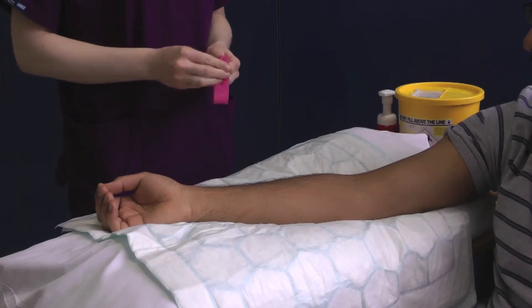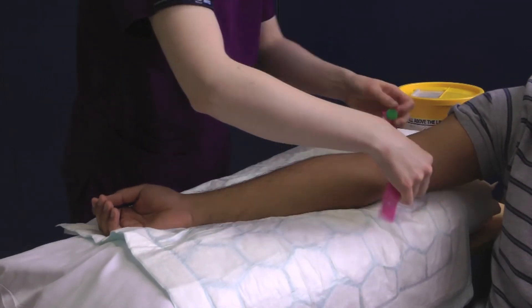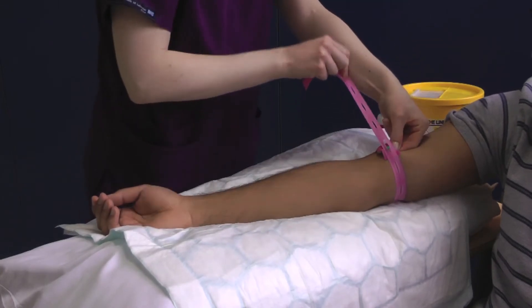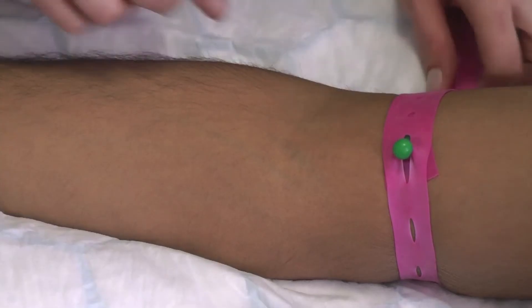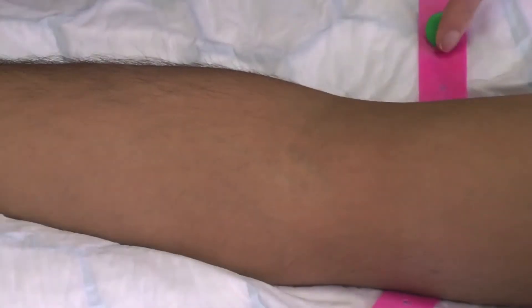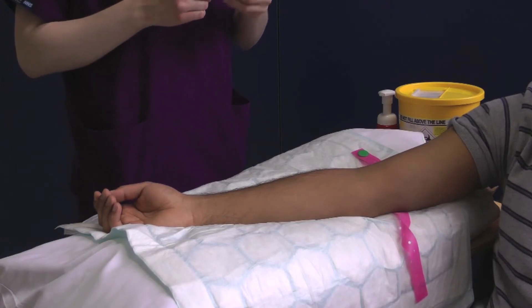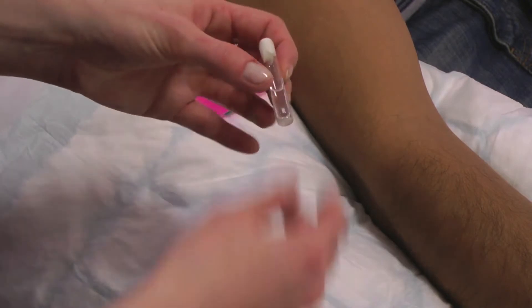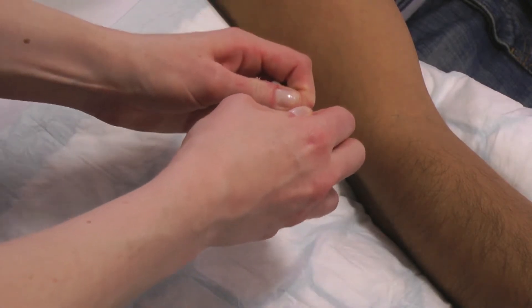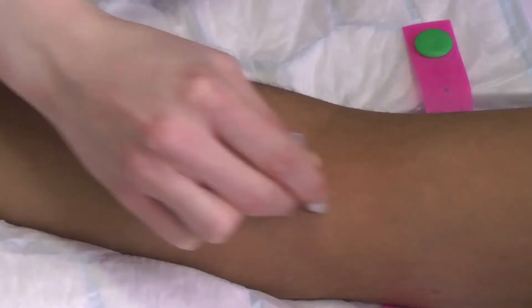Apply a disposable tourniquet to the patient's arm and palpate for a suitable vein. Once you have located the vein, release the tourniquet. Remove the chloroprep applicator from its packaging and squeeze until the inner tube breaks. This releases the chloroprep solution. Clean the proposed puncture site in a hash formation and allow to air dry for 30 seconds.